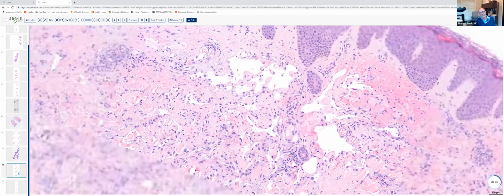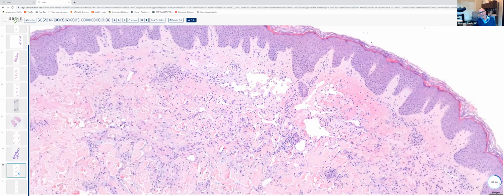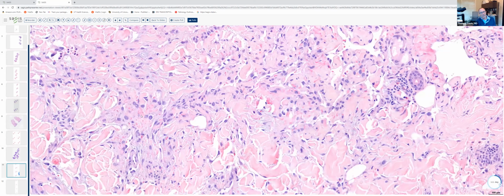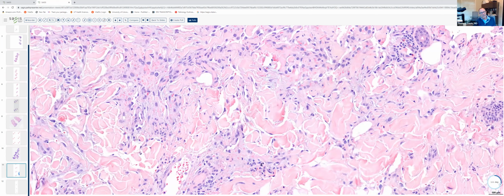So clearly we've got this vascular neoplasm here with these dilated endothelial-lined spaces, but it's got kind of a biphasic pattern. Centrally, we've got these dilated vessels, but peripheral and beneath that zone, the vessels are somewhat more compressed. They're still lined by somewhat plump endothelial cells. And in these areas where the vessels are compressed, they kind of appear to dissect between collagen bundles. We even have a little bit of a promontory sign here where we've got these vessels surrounding pre-existing vascular spaces.